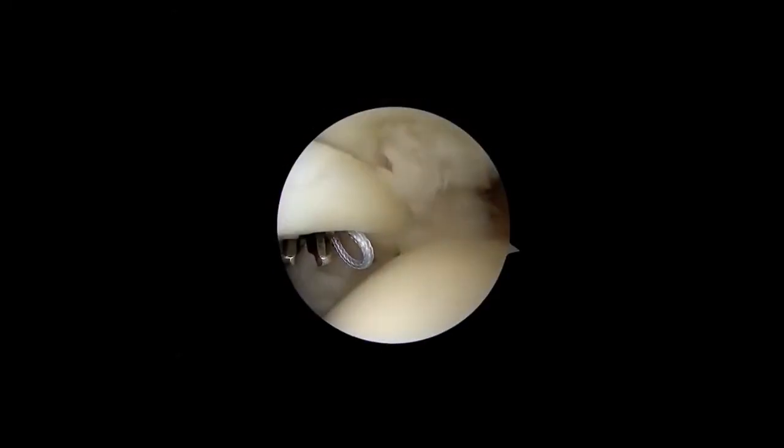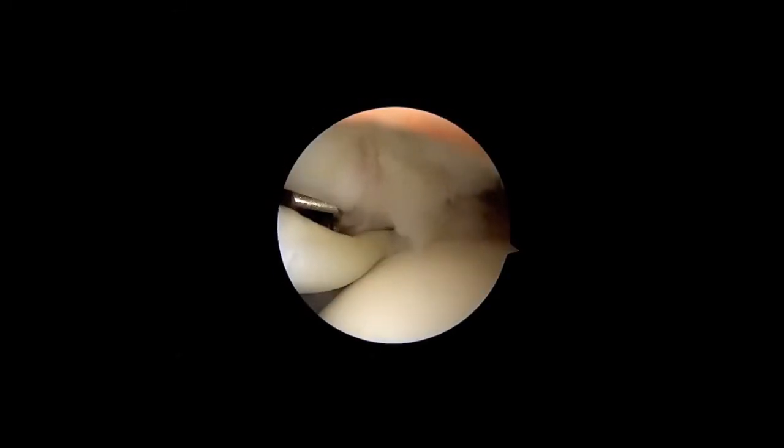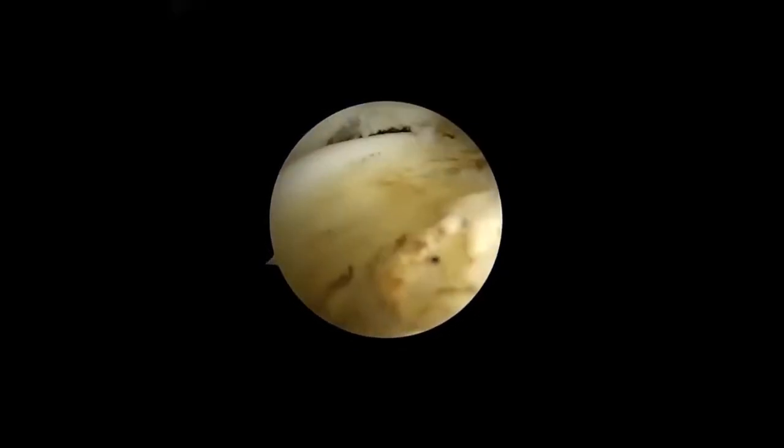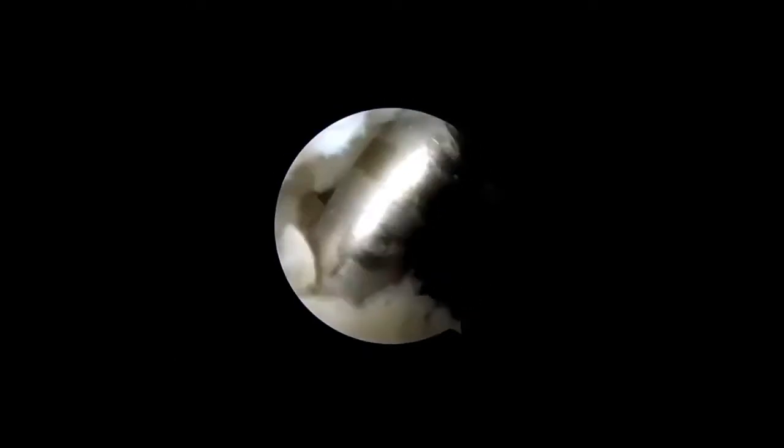Joint inspection is done to identify the rotator cuff tendon tear and any other intra-articular lesions. The long head of the biceps tendon is tagged, then tenotomy is done. After identification of the full thickness tendon tear, debridement is done before beginning with the repair. Then the footprint is prepared using the shaver.